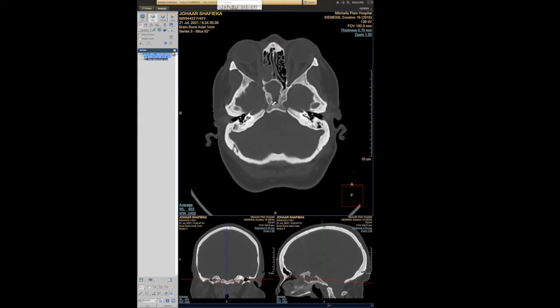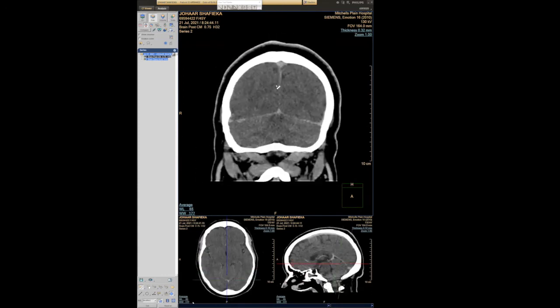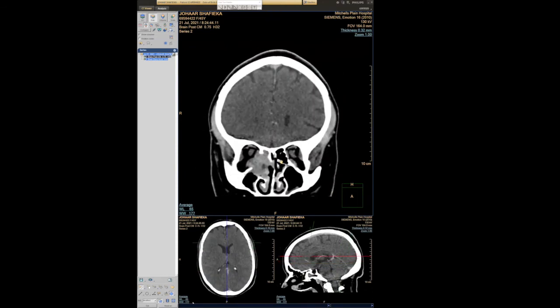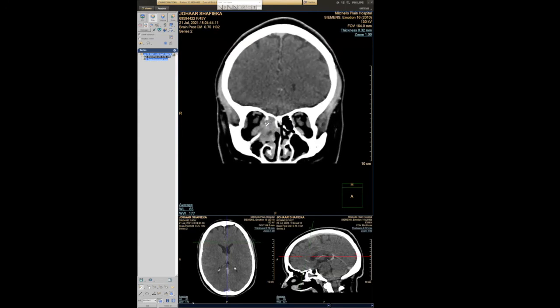You can also see that there is remodeling of the bone into the clivus. Then again, on this post-contrast study, I just want to show you the coronal plane. So again, you can see this mass extending into the orbital cavity, where there's loss of the normal fat plane between the medial and inferior rectus muscle. This is extending via the bone erosion of the lamina papyracea, and extending inferiorly into the maxillary sinus.